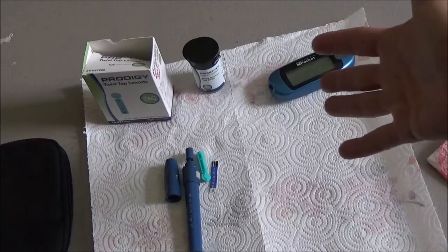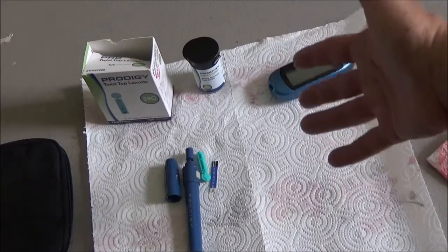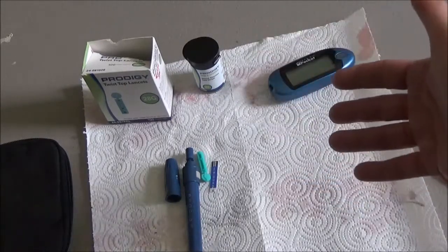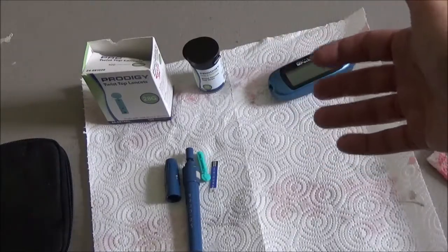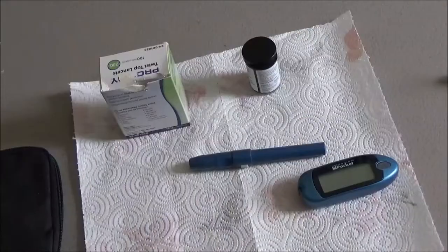Okay, physiology class, welcome to the blood glucose regulation lab. Okay, so I just had lunch, I had a meal. So at time zero, immediately after having that meal, I'm going to measure my time zero blood glucose.